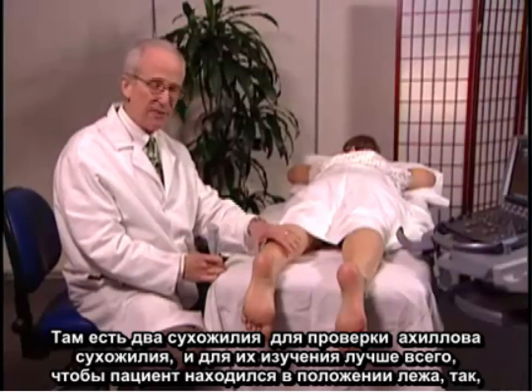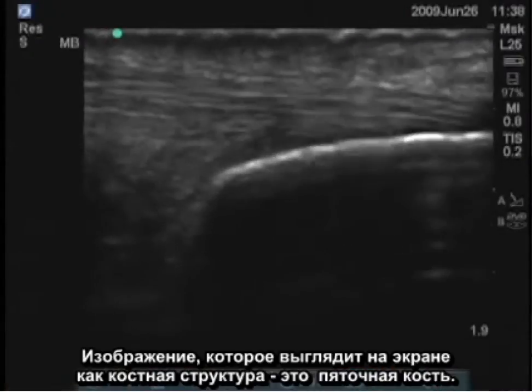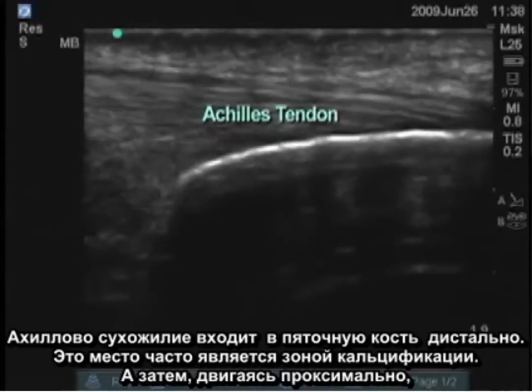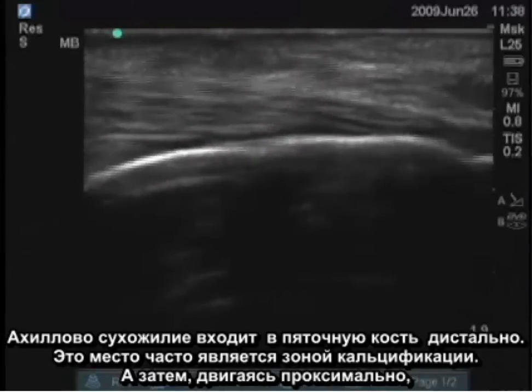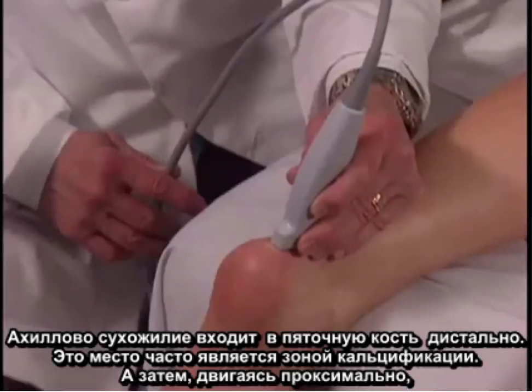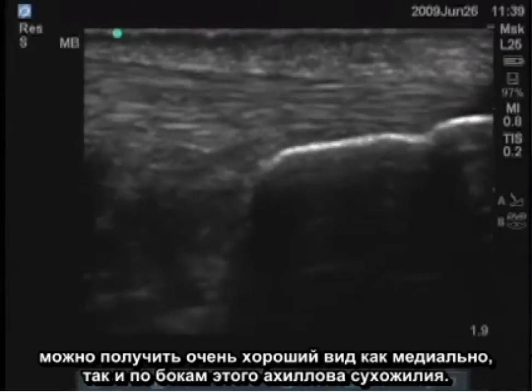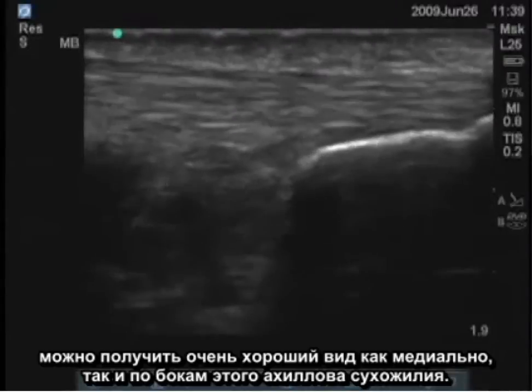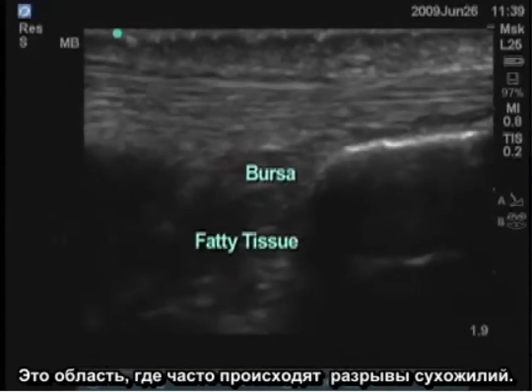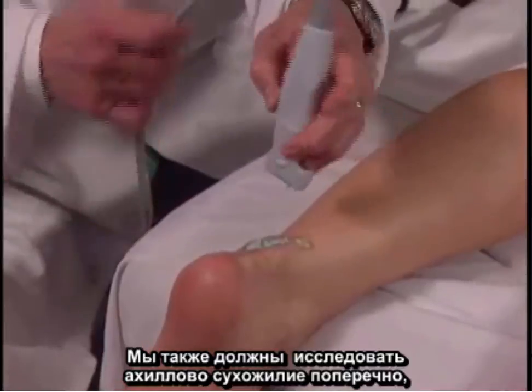For examination of the Achilles tendon, it's best to have the patient in the prone position. The bony structure you see on screen is the calcaneus, and the Achilles tendon is inserting into the calcaneus distally. This is a frequent zone of calcification. Going proximally, you can get a very nice view both medially and laterally of the Achilles tendon. The structures deeper to the tendon include a bursa and some fatty tissue. This is the area where many tendon tears occur.